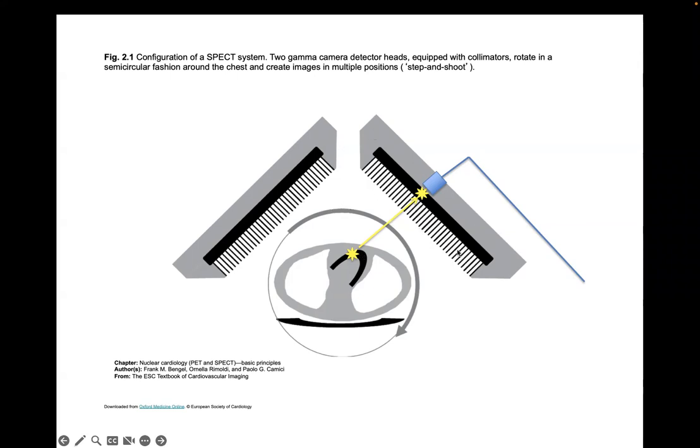And this set of detectors is aligned in this straight line projection such that if I have an event over here and it goes straight towards the detector, I'll detect it at this point on the detector. So you want a projection of the patient onto this angle. And so if I have an event over here, but the photon comes this way, you want to stop that photon because you don't want to have an excitation occur here. The detector records an event over here, and it will assume that that event came from somewhere along this line in the patient, which is wrong. So that's why this collimator is in place, to keep the detection limited to those events that occur with a straight line projection down through the patient.